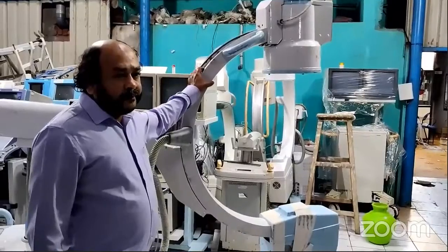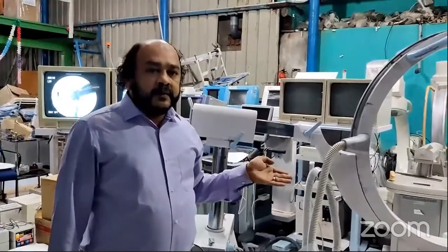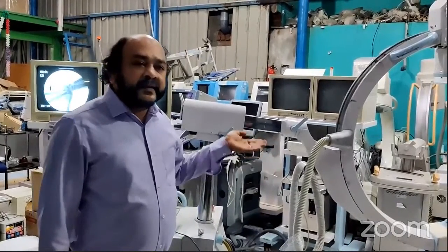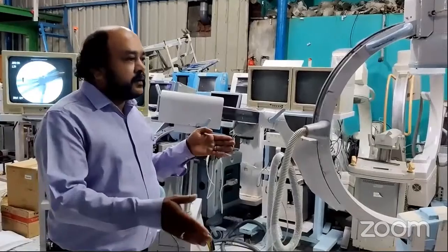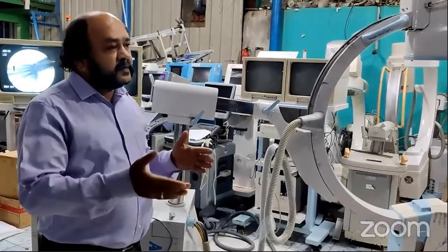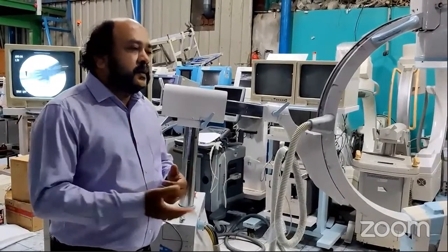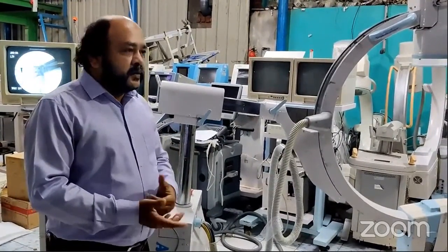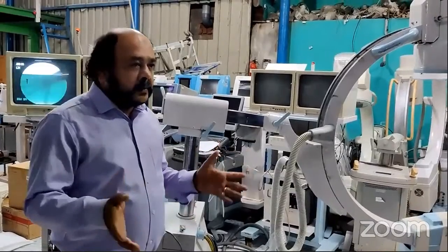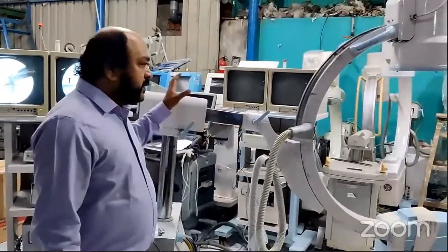Actually, this is basically again the X-ray family. What is the difference between X-ray and C-arm? In X-ray, it will be fixed in one place. You can take the object or anatomy in between that, and you can take the images. Images means it will come through the film. Or nowadays, there are a lot of new technologies like computer radiography, the CR system, and the DR system. So many new techniques have come. Okay, so earlier, the C-arm was invented in 1955.